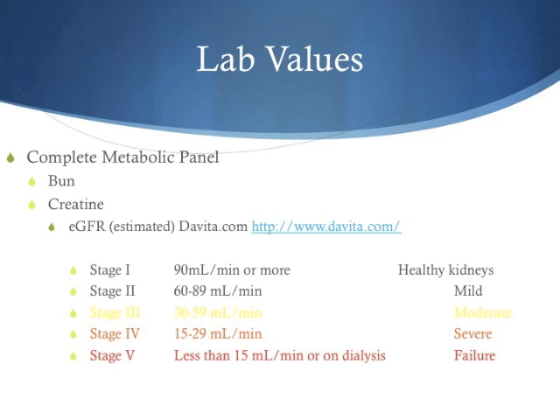A lot of facilities use age 50 or over, 55 or older, 60 or older. They will require a creatinine be done prior to the exam being performed if it's going to involve contrast. Is that enough for your department? Do they require an estimated GFR to be calculated?